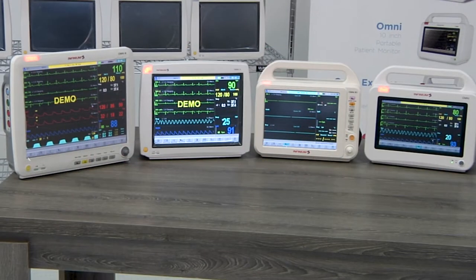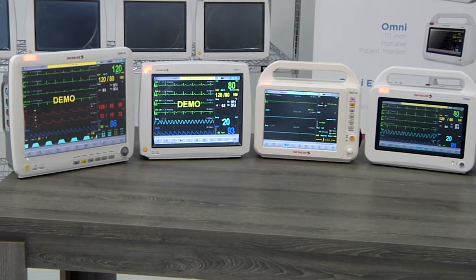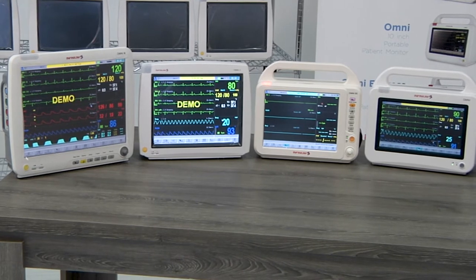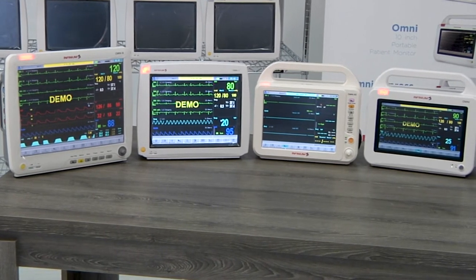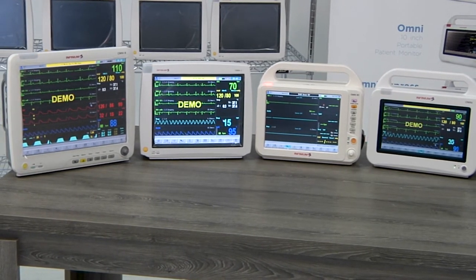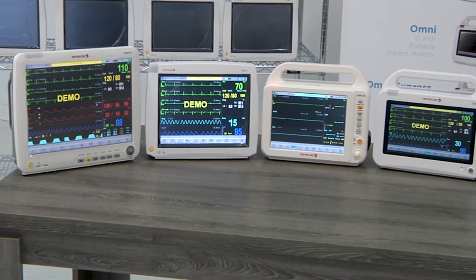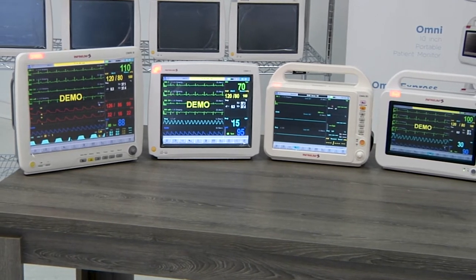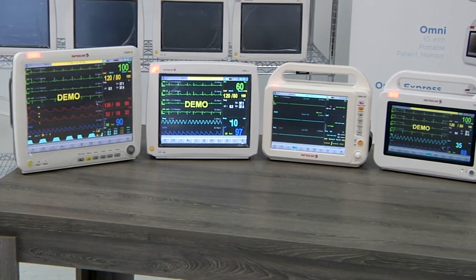Our monitors from 10 to 15 inch displays all have the basic functions of a 3 lead or 5 lead ECG, respiration, an IBP, SpO2, and two channels of temperature.